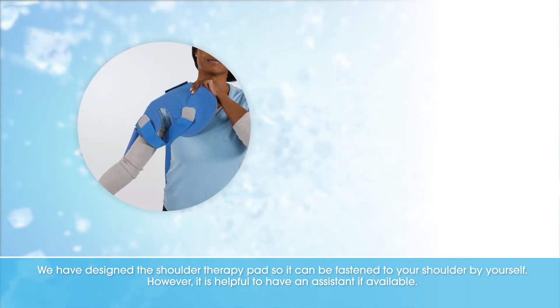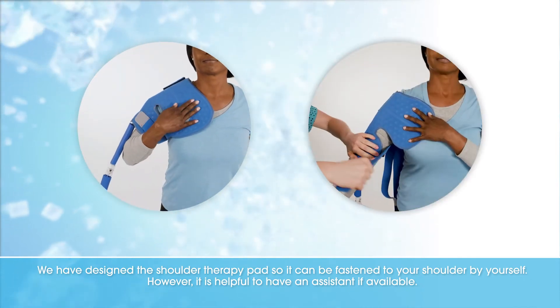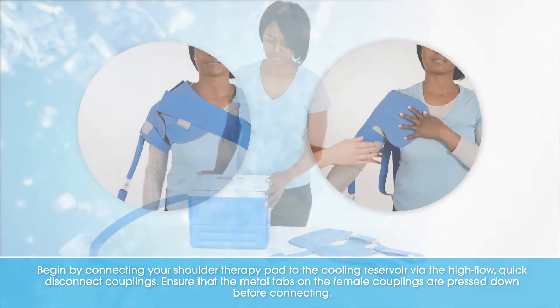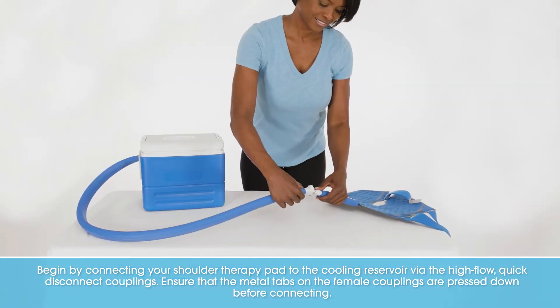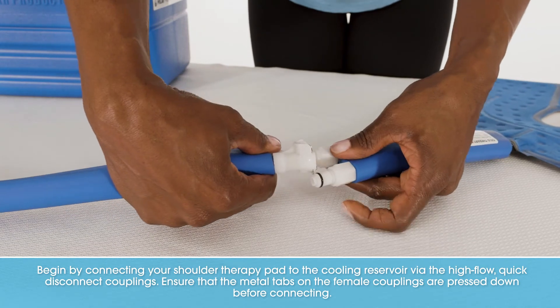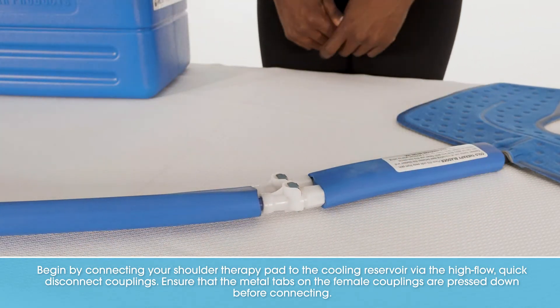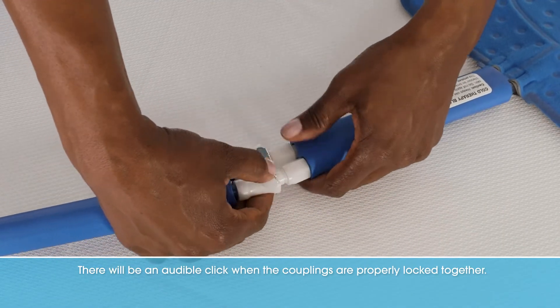We have designed the Shoulder Therapy Pad so it can be fastened to your shoulder by yourself. However, it is helpful to have an assistant if available. Begin by connecting your Shoulder Therapy Pad to the cooling reservoir via the High Flow Quick Disconnect Couplings. Ensure the metal tabs on the female couplings are pressed down before connecting. There will be an audible click when the couplings are properly locked together.